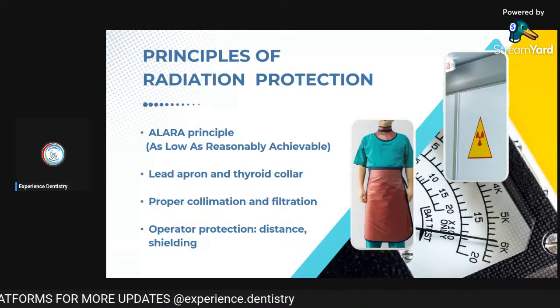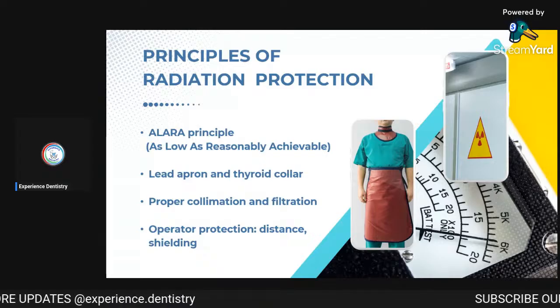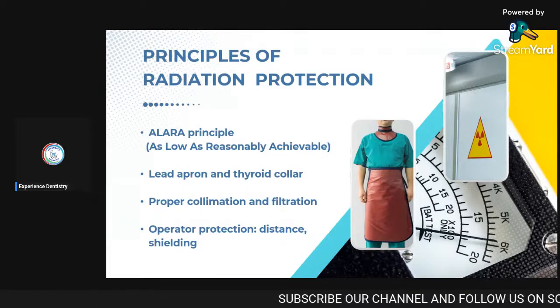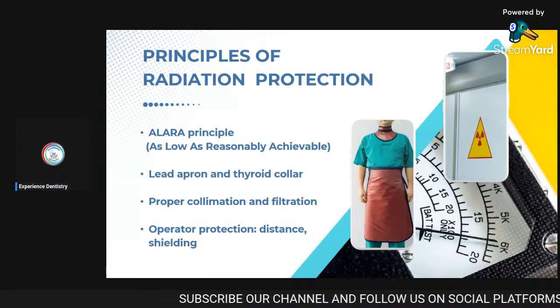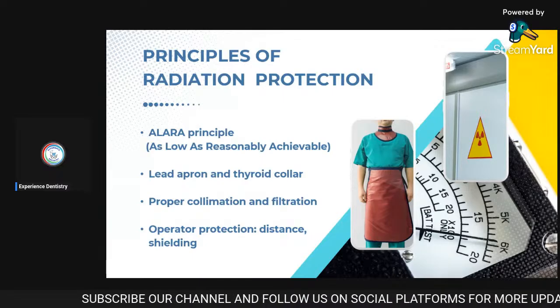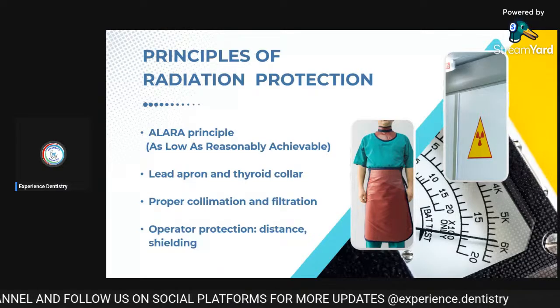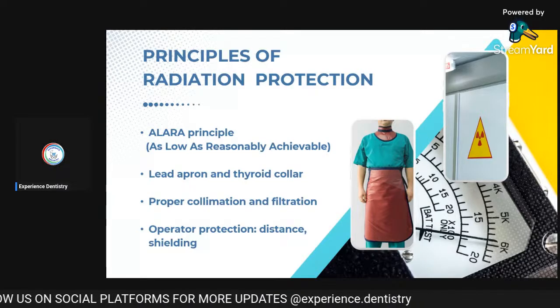Especially in the situation when there is a pregnant woman or a person who is immunocompromised, you need to make sure that they wear both of these when they are going towards the X-ray, because X-rays are very harmful for a pregnant woman.